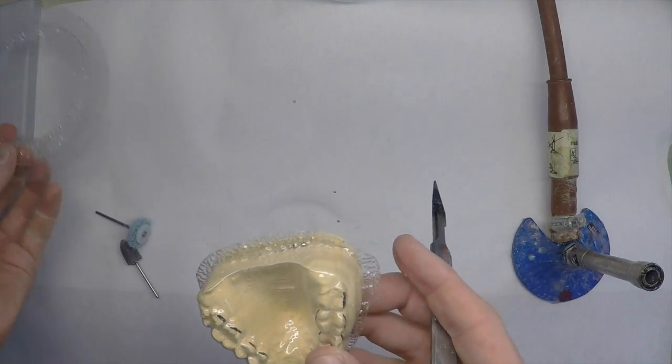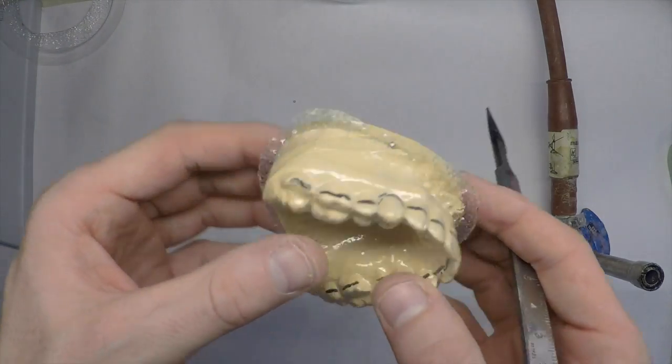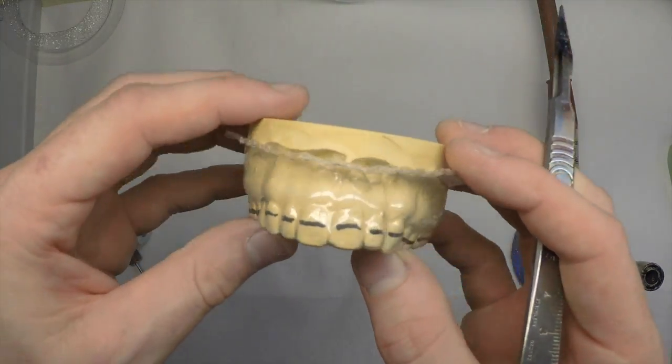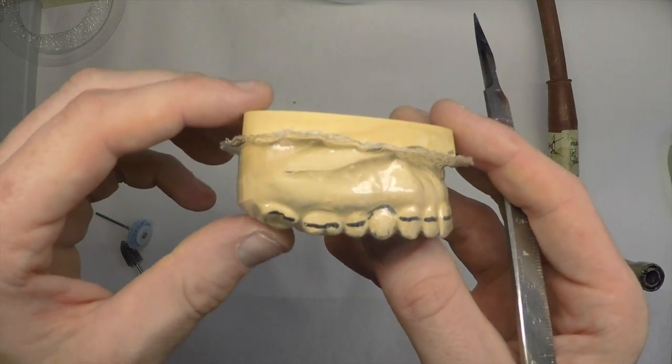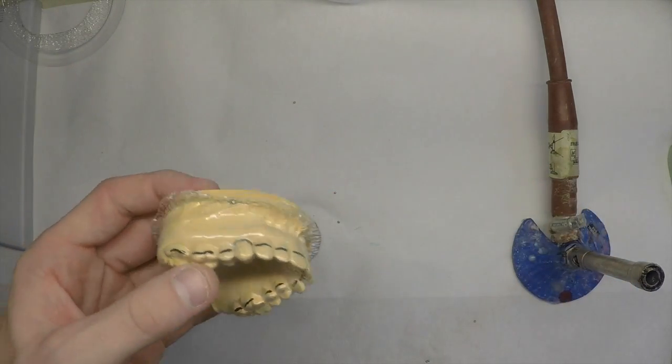Now we've removed the excess, we can trim the stent down to the black line that we've made on the model.